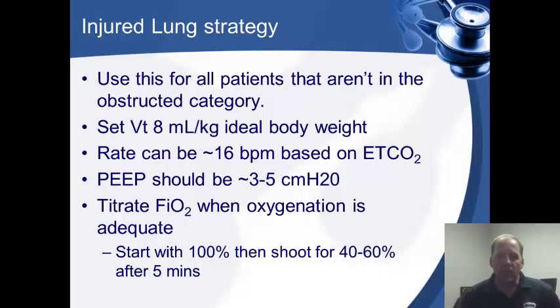You can set the tidal volume to be about 8 mL per kg. Remember, this is ideal body weight. Don't increase the tidal volume just because the patient is obese or just a little bit larger. Make sure you base this off of their height. You can use a chart or whatever for that, and you can calculate it out. We just want to be on the safe side of this. Make sure we don't overventilate these lungs, because remember, tidal volume equals lung protection.